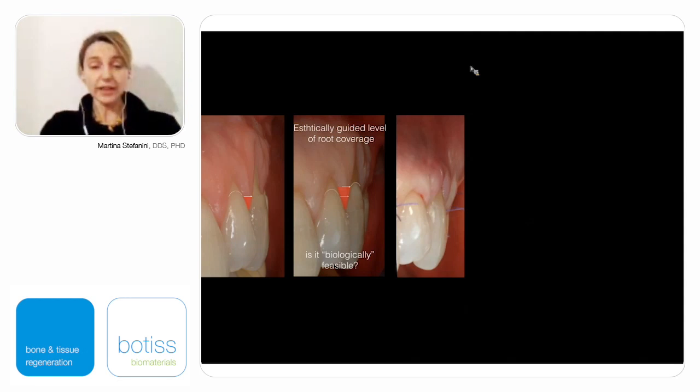And with the sling suture, we can tightly adapt the gingival margin above the new restored convexity of the clinical crown, giving a primary intention closure that will ensure the stability of our blood clot under the coronally advanced flap.